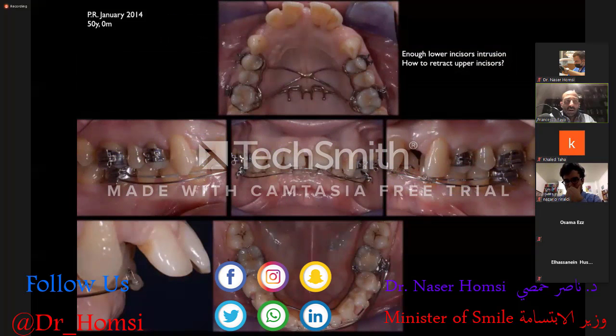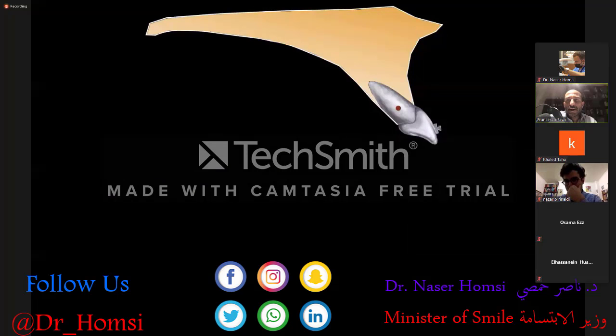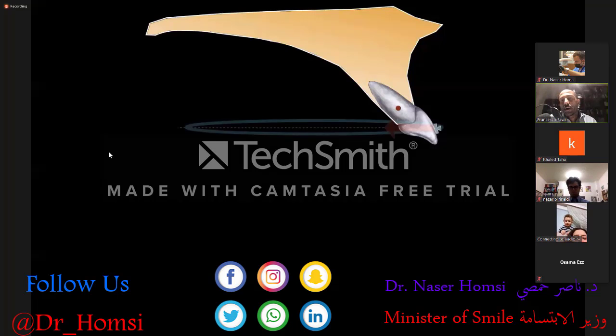After beginning the lower incisor intrusion, we perform enough lower incisor intrusion. So the next need is to retract the upper incisors. Let's decide together how to make an upper incisor retraction, and let's think together about what happens if we try to use, in this case, a class 1 elastic force for retraction.